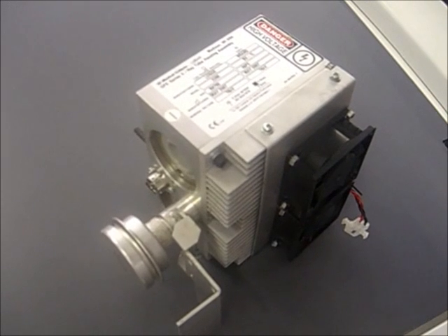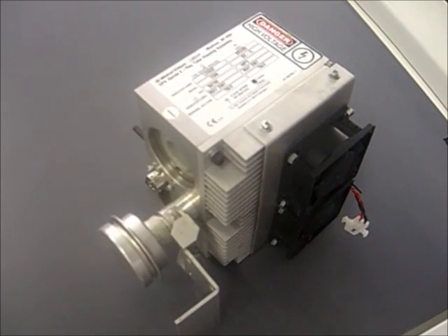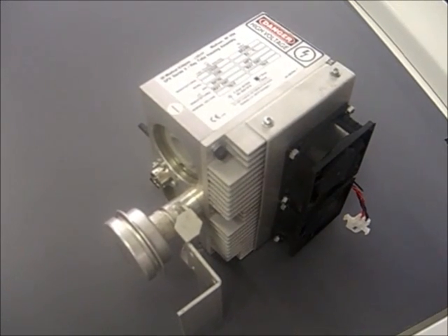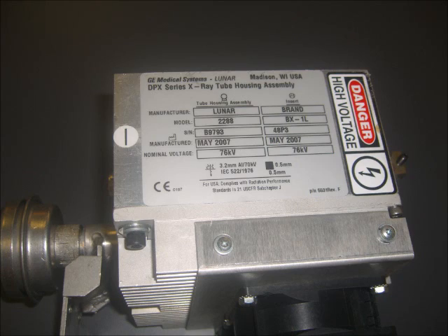The first tube we want to discuss is the DPX Series IQ, model number 2288. To find the model number of your tube, please reference the tube ID tag and look in the upper left-hand corner.